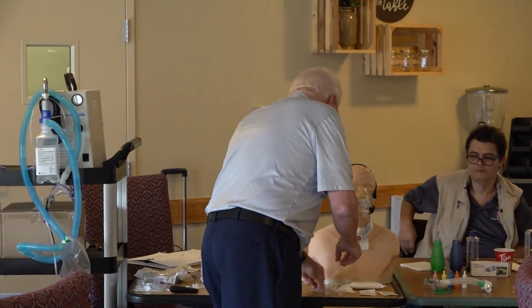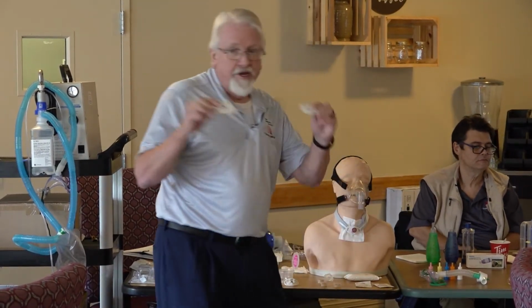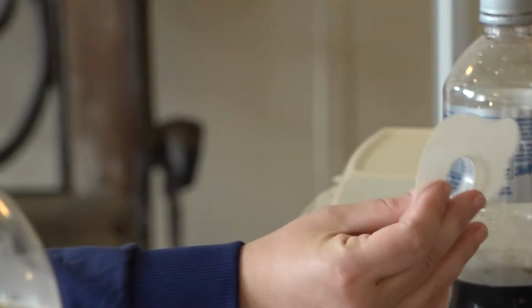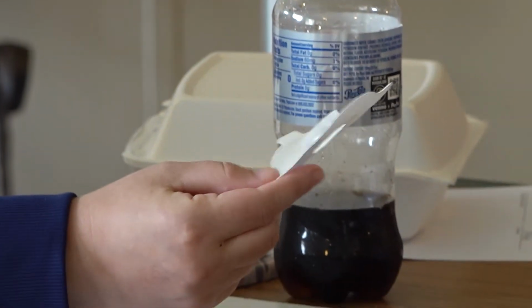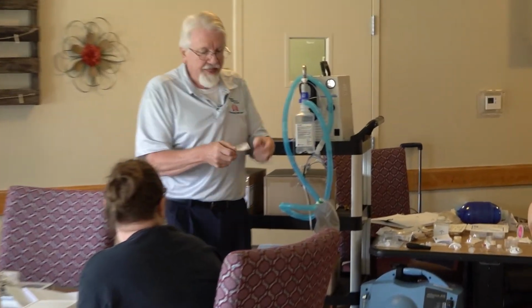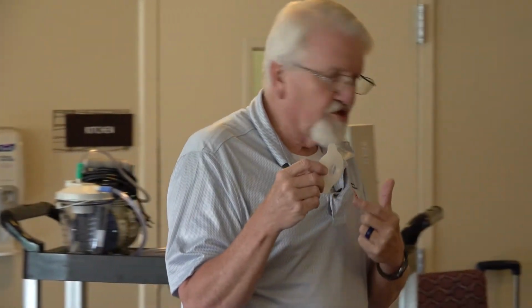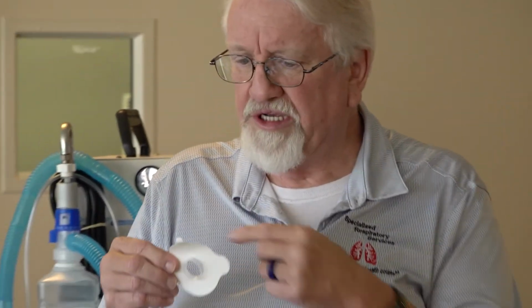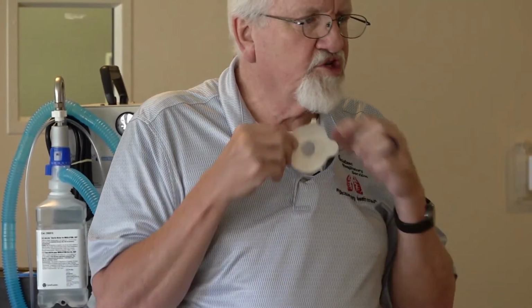Now, not all patients with a laryngectomy are going to use the Lary tube. They may opt to use one of these. This is called a Stabilabase. The back side of it is adhesive, so you peel off the backing, and these come in about 14 or 15 different configurations, so you can match the patient's anatomy to get a good fit. And all you're going to do is place that opening over their stoma.